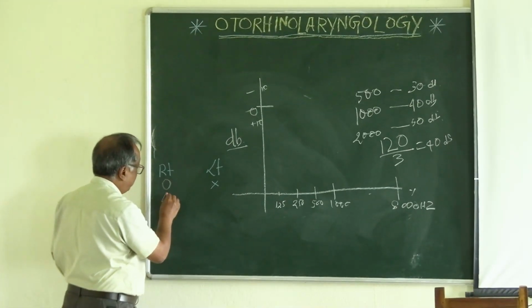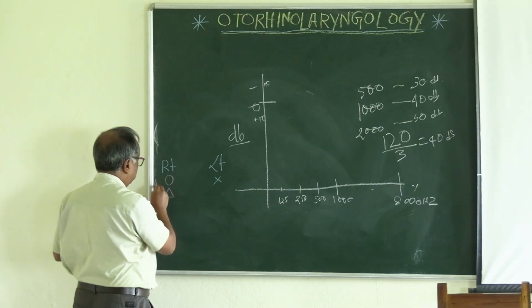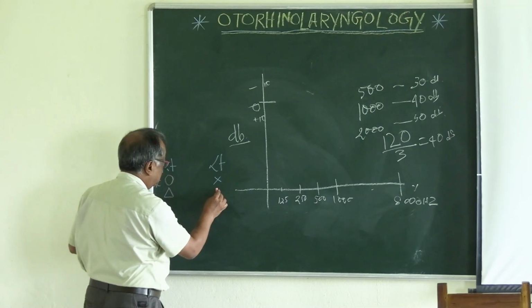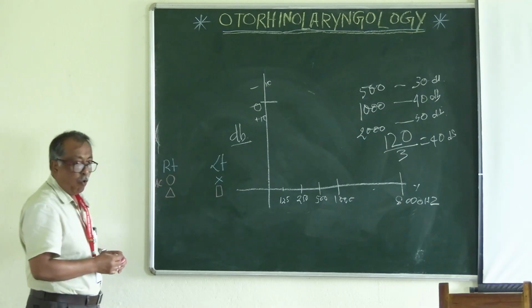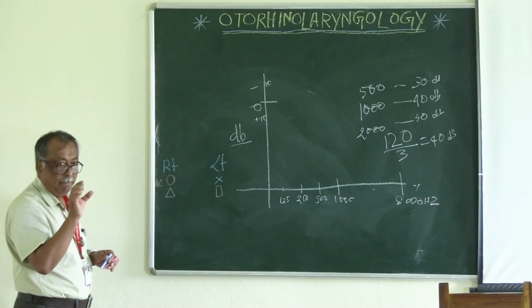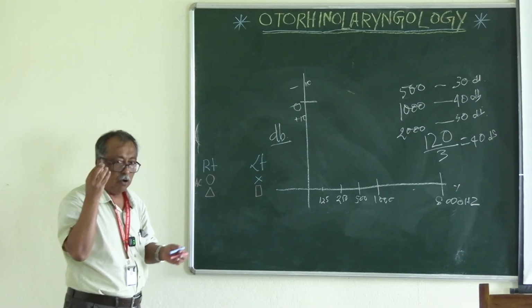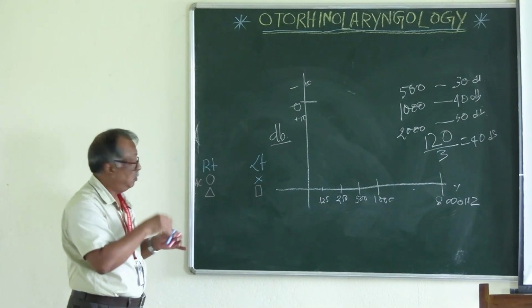That is a triangle. AC with masking in the left ear, that is a rectangle. Now coming to the bone, the masking by the band of noise, Barany box or anything. Sometimes in modern audiometry machines, there is automatic masking, masked according to the matching of the threshold.